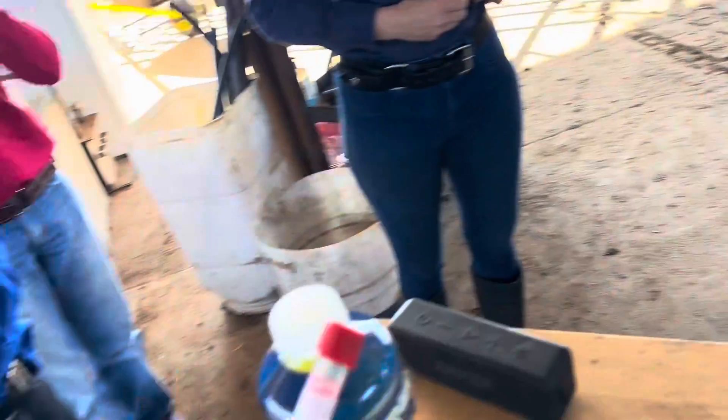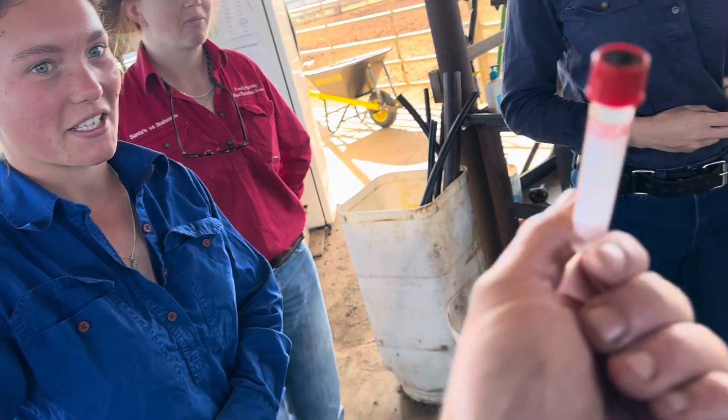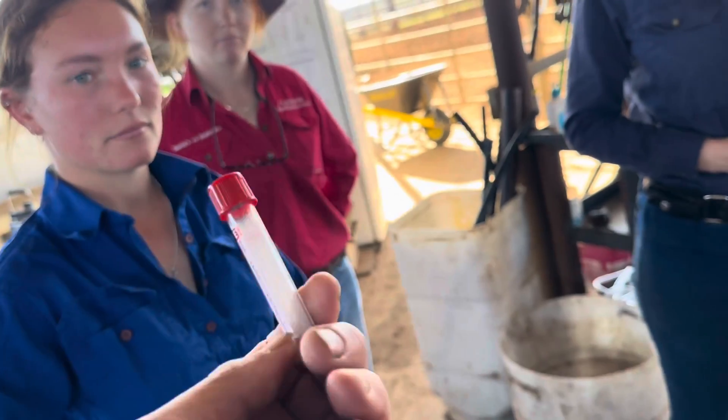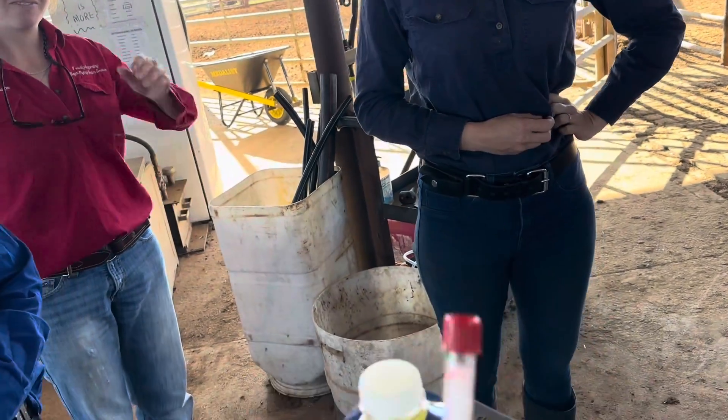These are called vacutainers. Why do you think they're called vacutainers? Well, it says vacuette. Vacutainer, vacuette. So they've got a vacuum in them. Why do they have a vacuum in them? Because this job sucks — so the blood sucks into them.